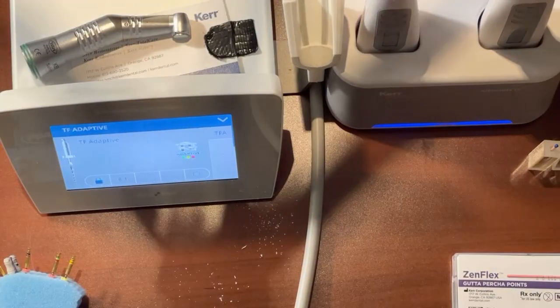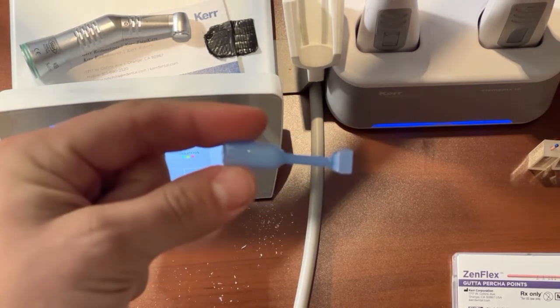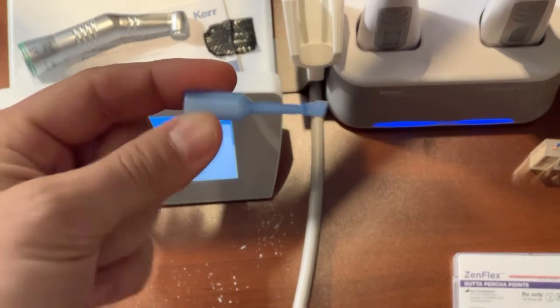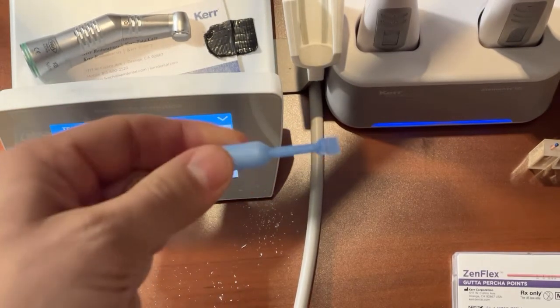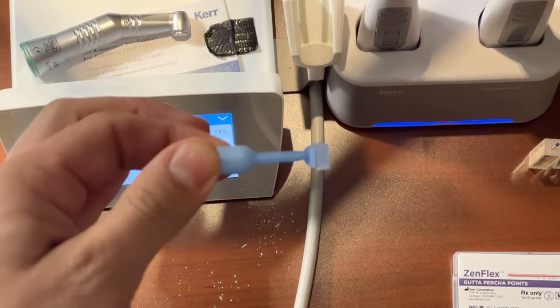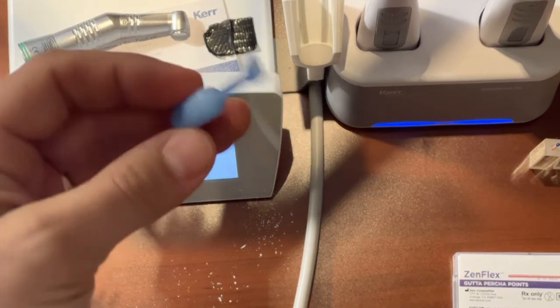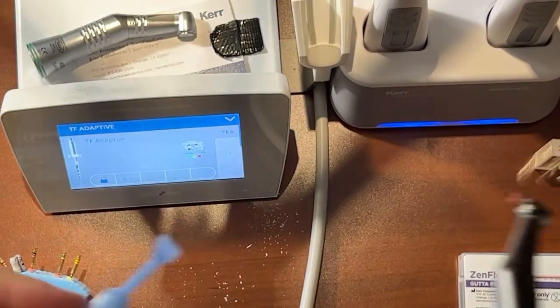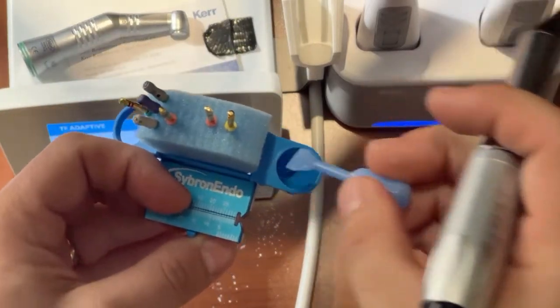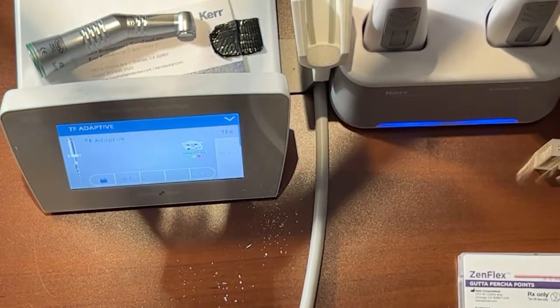And then for each file, I'm going to be using something called slick gel. That's just to help lubricate the file. It has EDTA in it. It's similar to an RC prep. It just has everything in there that starts to break down the hard tissue. So that is our slick gel, and you can put that directly into this little gel well here, and you can continue to dip the file in and all that fun stuff.